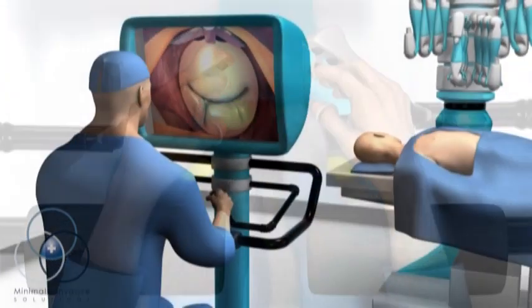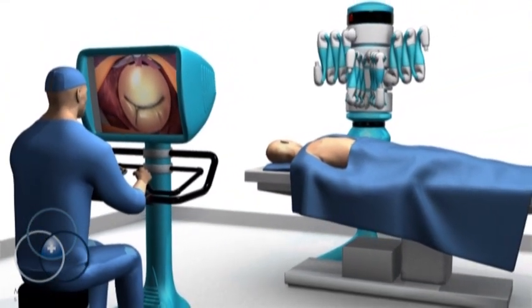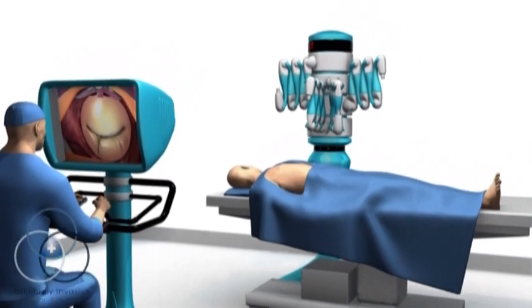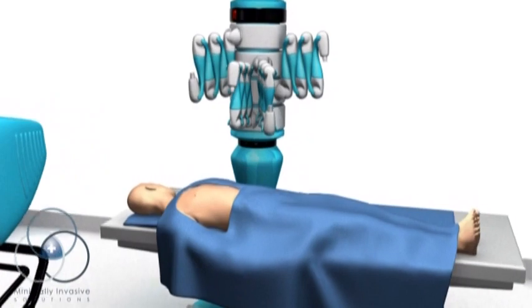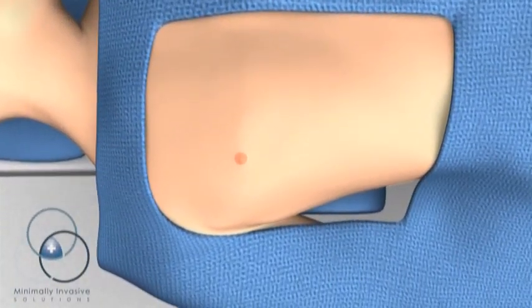This combination enables the surgeon to perform very complex and delicate surgical maneuvers through smaller incisions than traditional surgery. Patients lie on their back during the operation and are asleep under general anesthesia until the operation is completed.